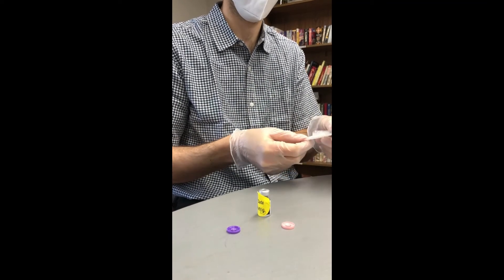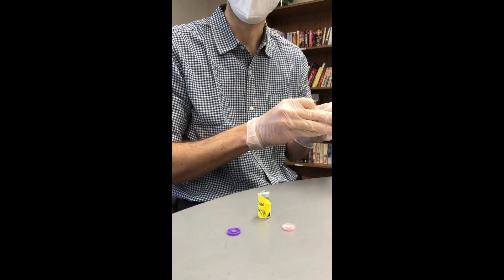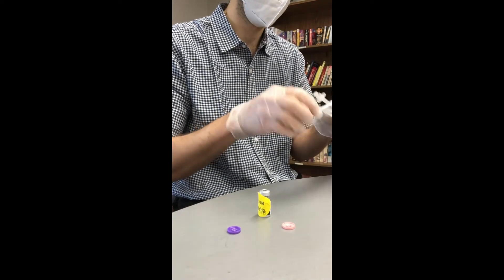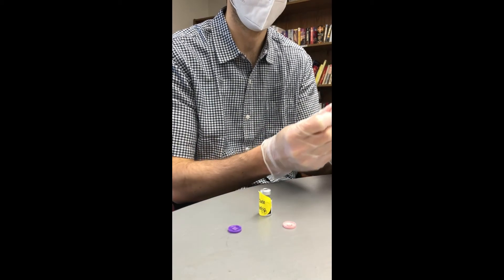And then for your normal 1-inch needles, you're just going to do 0.3. I'll do 1, for example. You'll usually get about 6 doses out of each of these vials.